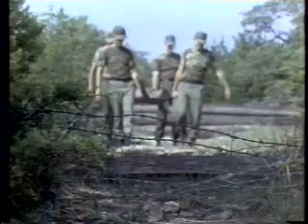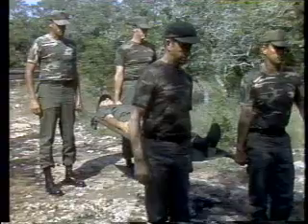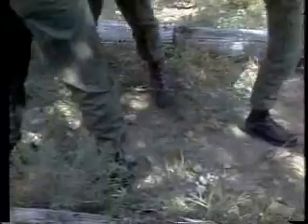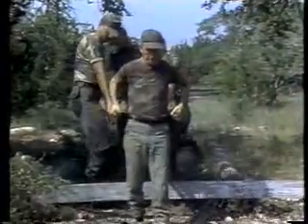The next obstacle you'll see will be that of low barbed wire tanglefoot. Here we need a carry that's going to provide additional stability to the team in case one member were to trip and fall. Again, the team will use the litter post carry. Note, as the team members go through the wire, the personnel along the side rails do not cross their feet. They sidestep, lessening the chances of falling and thereby hopefully preventing an injury to the patient. Again, if one team member should fall, we note that the team still can support the weight of the patient.